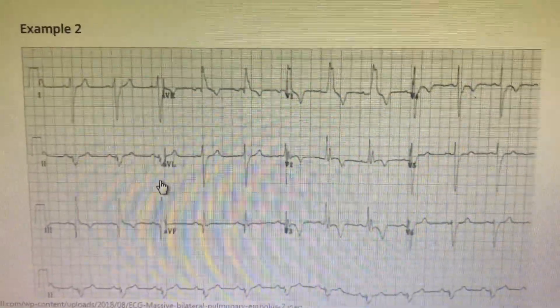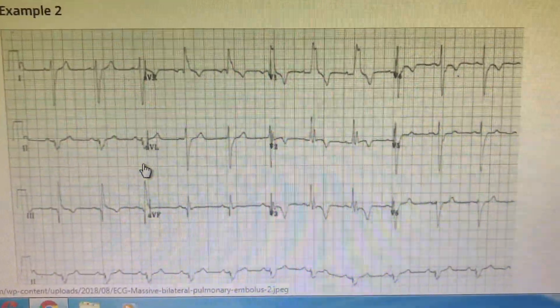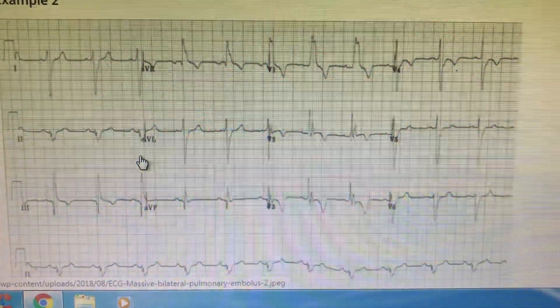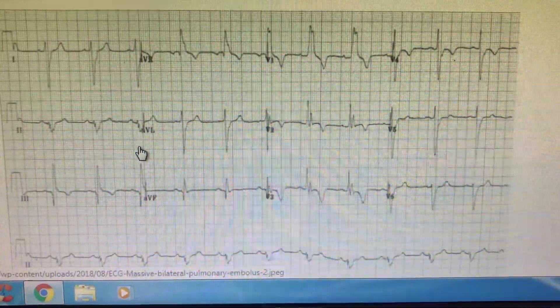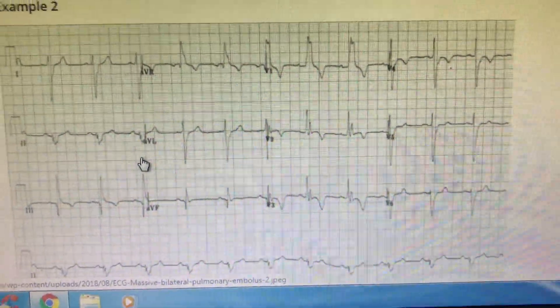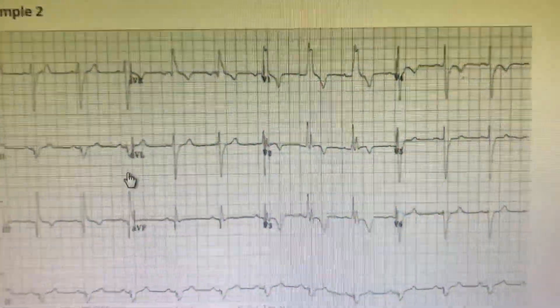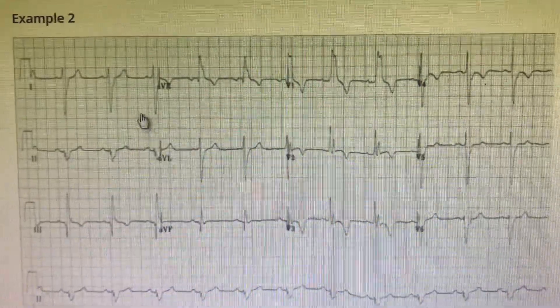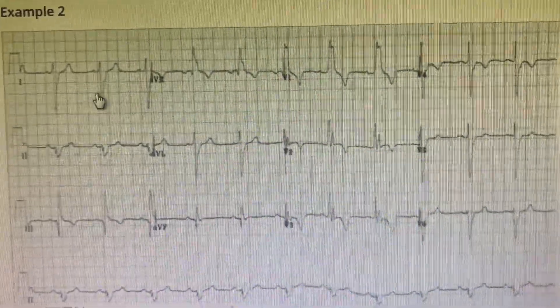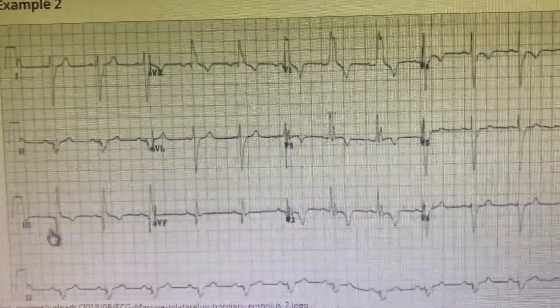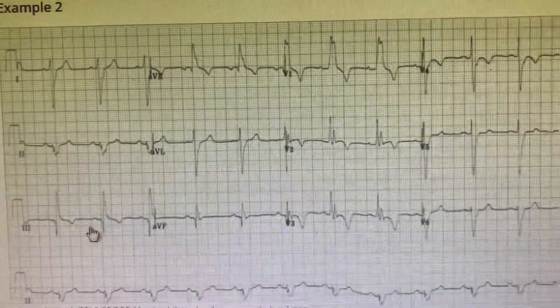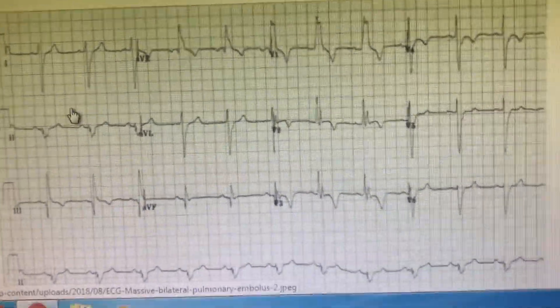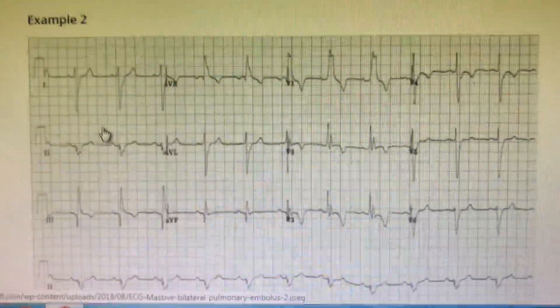In this similar ECG, RVBB is present, first-degree AV block is there, and there is a deep Q and T wave inversion. You can consistently see that the S1Q3T3 pattern is very, very clear in this ECG. There is a deep S in lead 1, a deep Q in lead 3, and a deep T wave inversion in lead 3 — so S1Q3T3 for beginners is something like this.